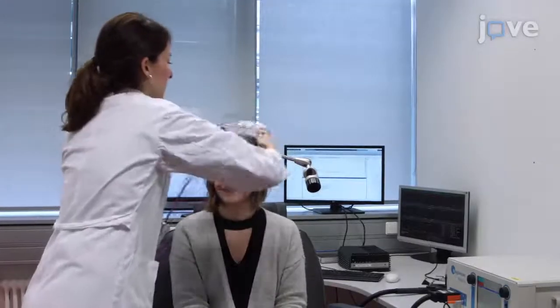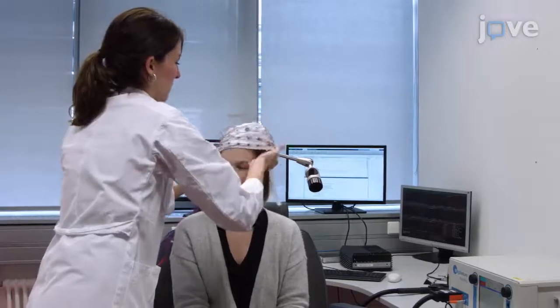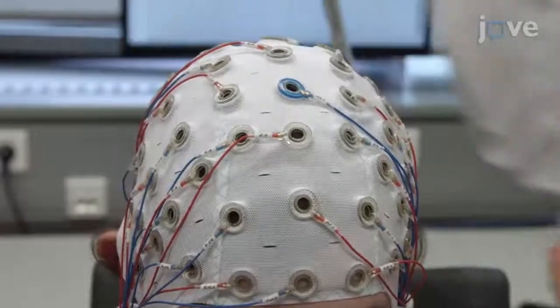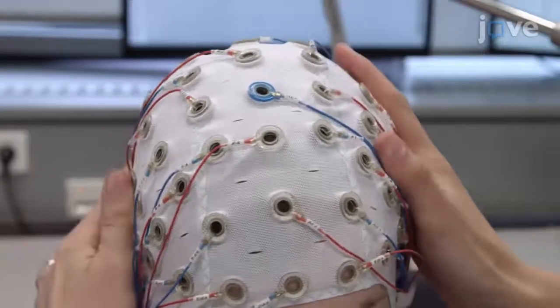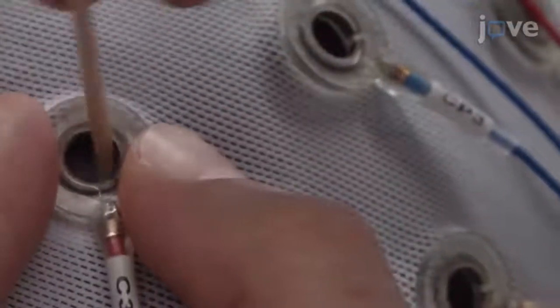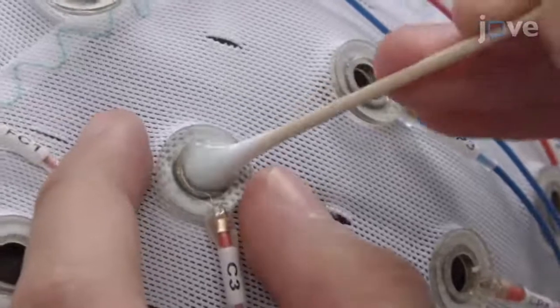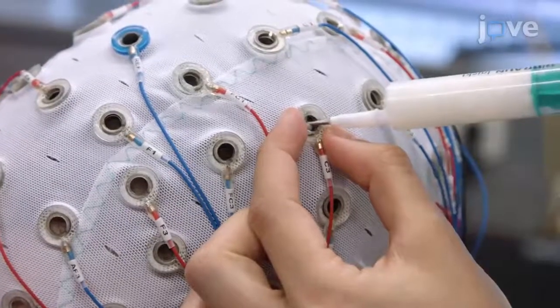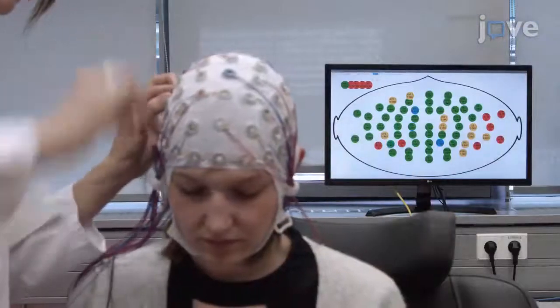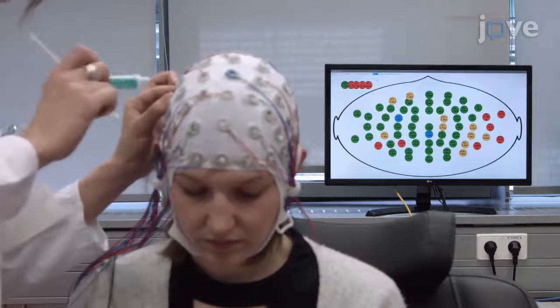When the system is ready, place an appropriately sized EEG cap on the head of the study participant and use measuring tape to position the cap correctly. Push the hair aside so that the scalp is visible and prepare the scalp with an abrasive gel application. Next, apply conductive gel to the electrodes and check that the EEG electrode impedances are below 5 kiloohms.